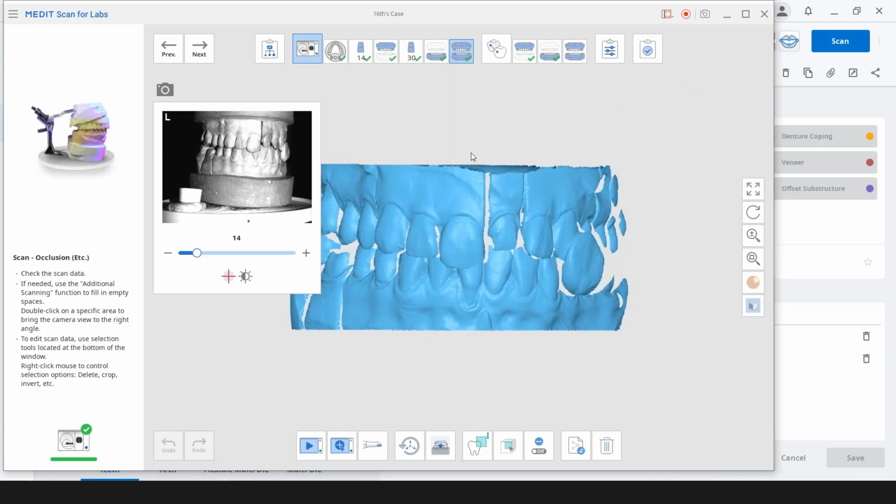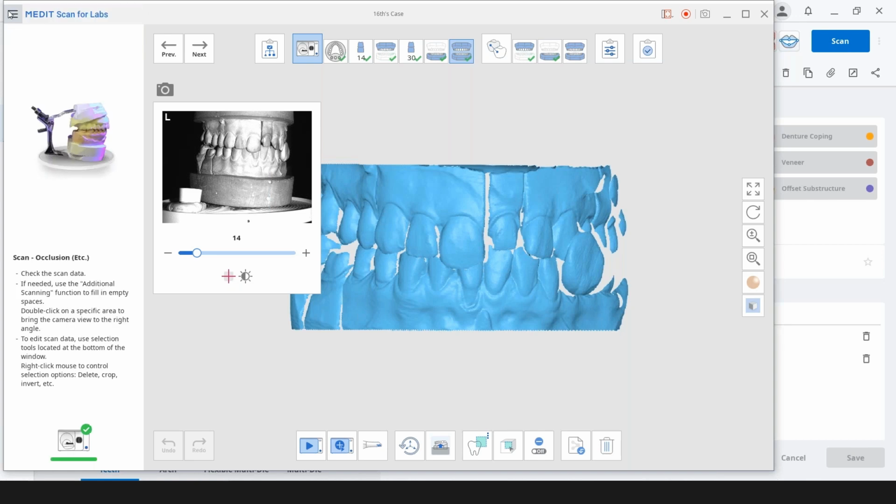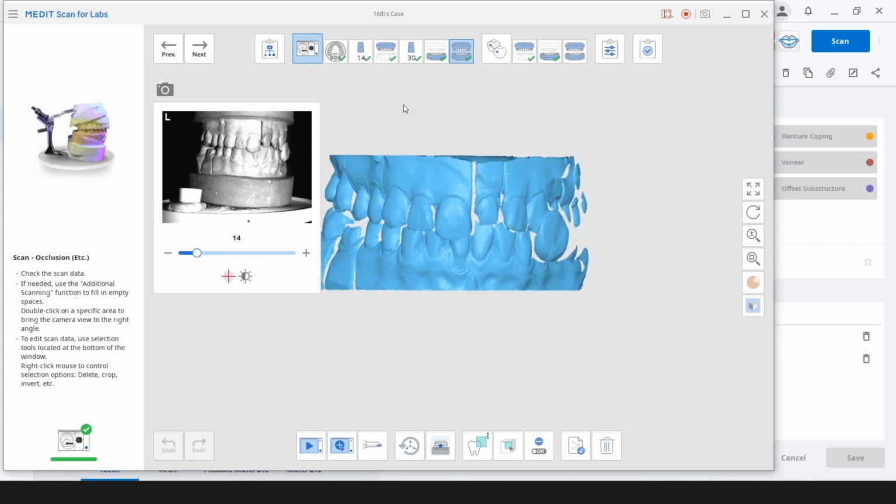It's good to look over. If there are any questions that they maybe haven't come across yet, they'll have the answers there regardless. And great, then About is where your serial number is. It also tells you what version of the scan software you're in, if you need that information. So that should cover it.